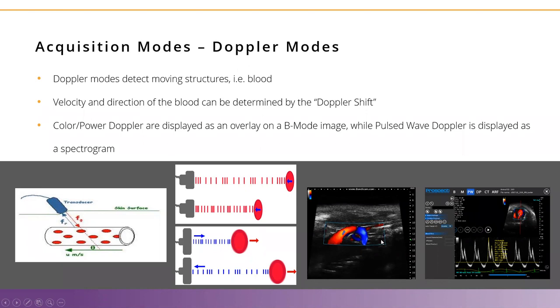And with color Doppler, we get an indication of directionality based on this scale. So anything that's red to yellow is going to be going towards the transducer, and anything that's blue to white is going to be going away from the transducer. So anatomically, this makes perfect sense. An acronym that most sonographers use to remember this is BART: blue away, red towards. Where you're seeing this little blue speck in the middle here, it's not in fact a reversal of flow. It's simply called aliasing, which means this scale has been maxed out and we've started to wrap around. So this would actually be the ideal place to measure the velocity of flow through the ascending aorta, because it's where it's going to be the fastest and most laminar flow.